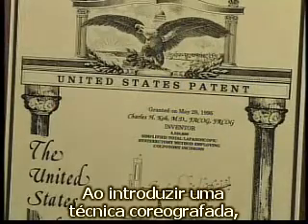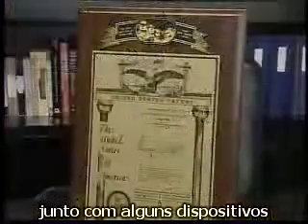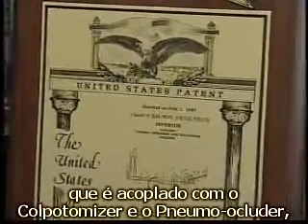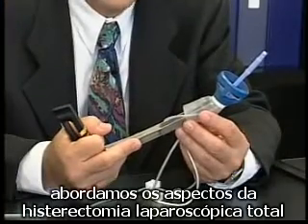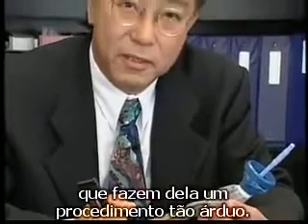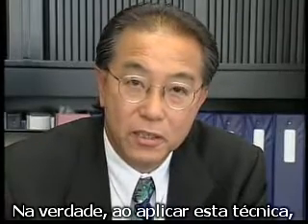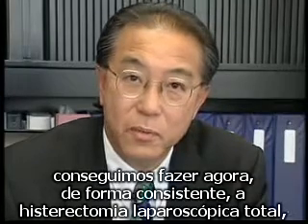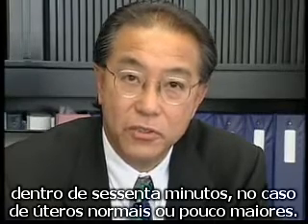By introducing a choreographed technique in association with enabling devices, namely the roomy uterine manipulator, which is coupled with the colpotomizer and pneumooccluder, we have addressed the aspect of total laparoscopic hysterectomy that makes it such an arduous procedure. In fact, by employing this technique, we are now able to consistently perform total laparoscopic hysterectomies within 60 minutes in the case of the normal or slightly enlarged uterus.